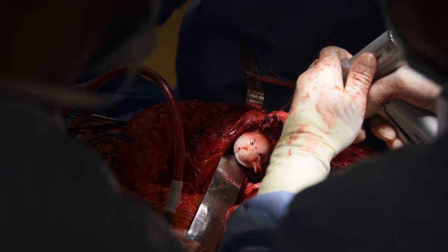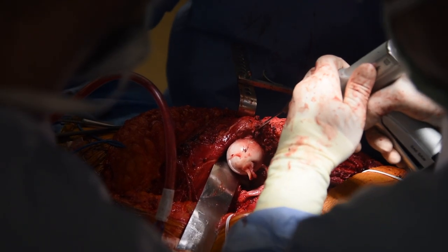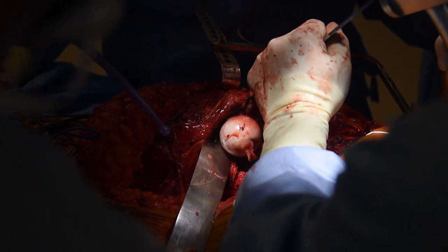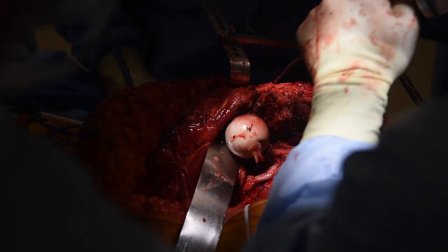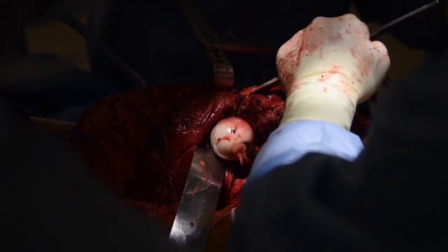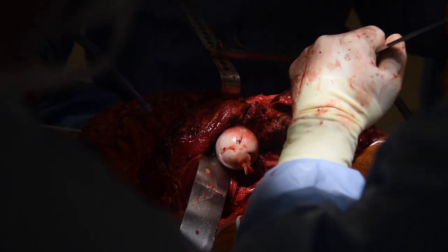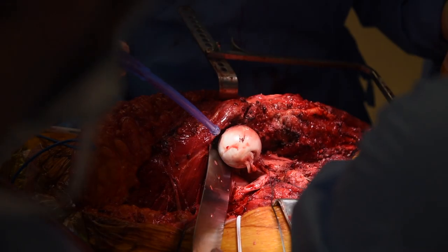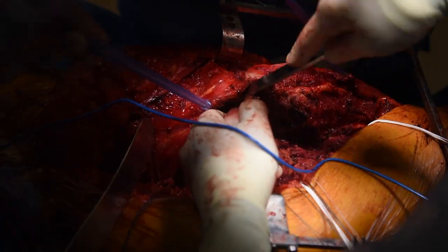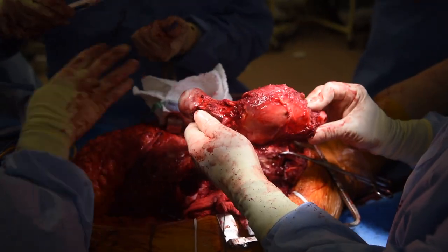Using the MRI images to calculate the distance from the greater trochanter to the soft tissue component, we measured 20 centimeters from the tip of the greater trochanter and transected the femoral shaft using a sagittal saw. We then removed the specimen, accomplishing radical resection.